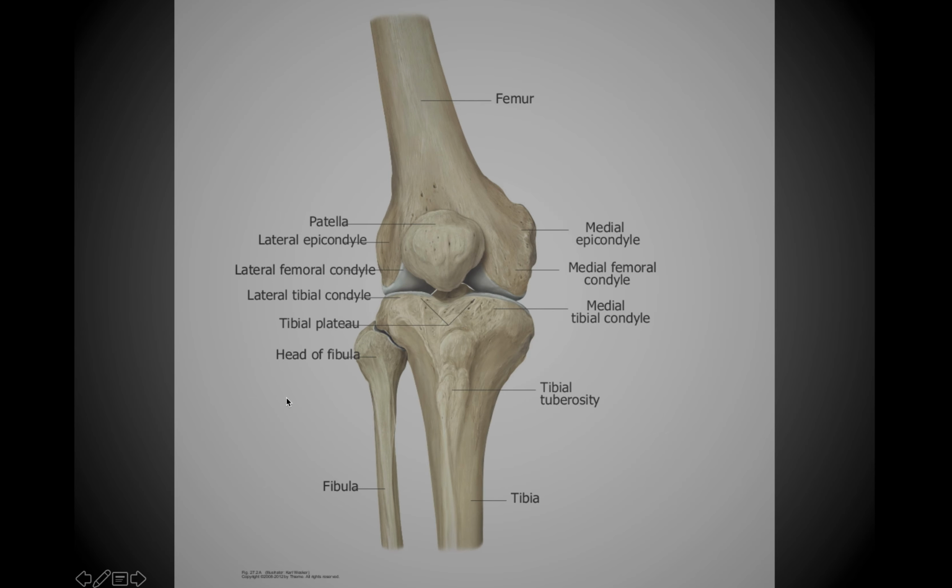This video is going to cover the knee and the tibia and fibula. Although the knee appears to be a relatively simple and straightforward joint, it actually has a lot of complexity, especially on imaging. I'm sure many of you have had friends, family members, or even yourselves experience MCL, ACL, menisci tears, etc.